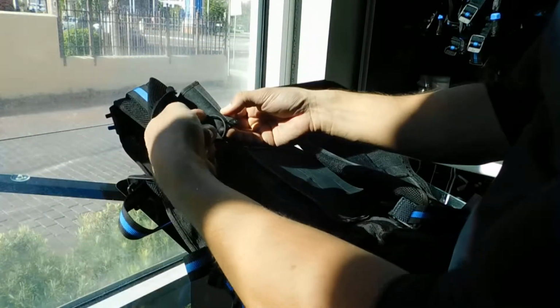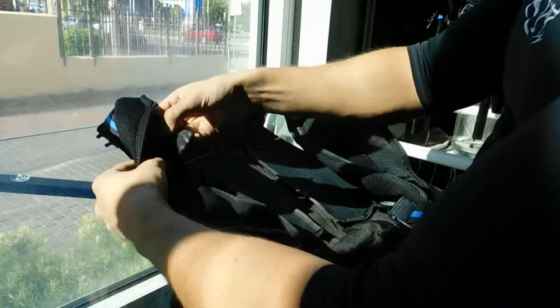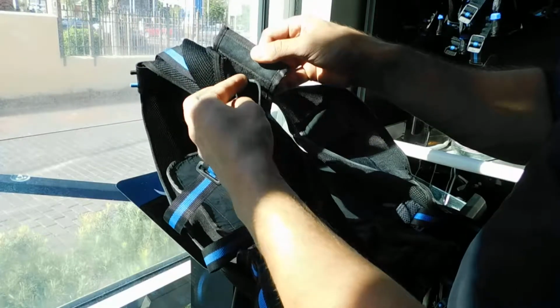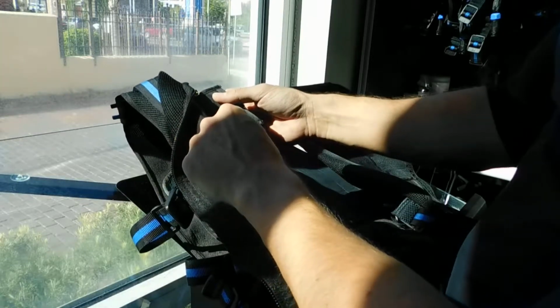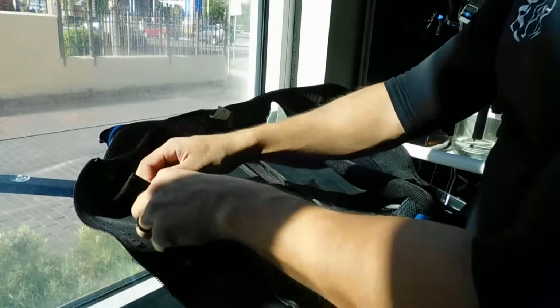Same thing with the chest, by the way. It happens all the time. You just have to make sure that you have this perfect loop out, and this is not broken somewhere here. So you have to be very careful that this right here is not breaking, let me see if you can see it right there, because right there is the most sensitive. I can show you. See that right there, how tiny it is? That's why I put the tape there, because it can break right there. Okay? So be careful. It has to be the perfect loop, which it is right now.